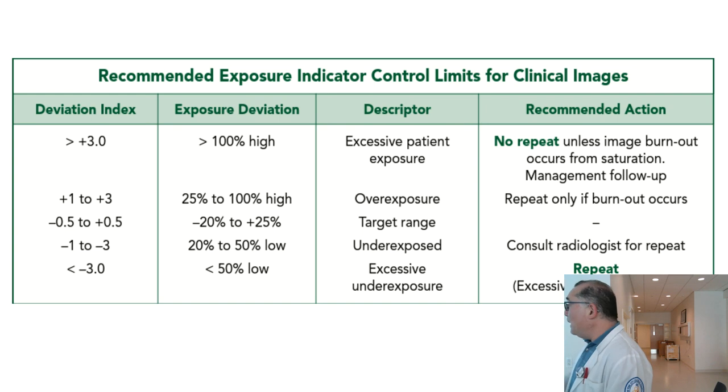Wouldn't it be nice? You just memorize these few numbers, not that many, and then you can have 12 part-time jobs. Right now, not only is it all over the place, but sometimes the ranges are different even based on the body part. So in our lab, from a finger to a femur, it's 150 to 250, right? But in another place, you might have a separate range, even on the same machine, for an abdomen versus extremities. Has anyone seen anything like that? A lot of times they have to post this stuff on the wall because it's kind of impossible to remember everything.